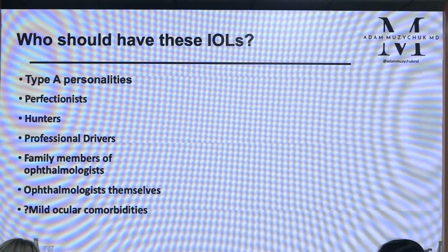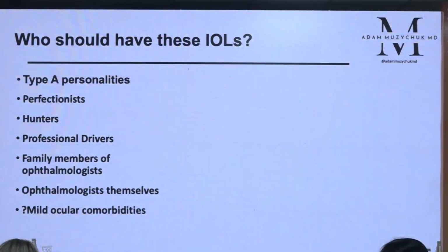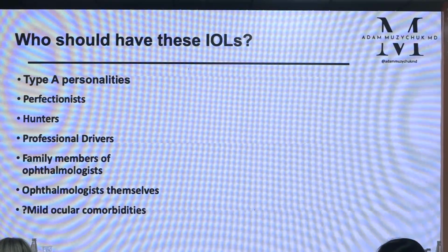If you remember going to any of the meetings about 10 years ago when the past lenses were on the market, you'd hear all of these ophthalmologists talk about these amazing new diffractive technologies, and you'd ask them at the end, what lens would you get yourself? And nobody would pick the diffractive multifocal lens. So when I was a resident, I decided that I was never going to implant these lenses without telling a patient, I wouldn't get this in my own eye, I wouldn't give it to a family member. You can choose it if you want, some people will still benefit from it, but I needed you to hear that before you pick it.